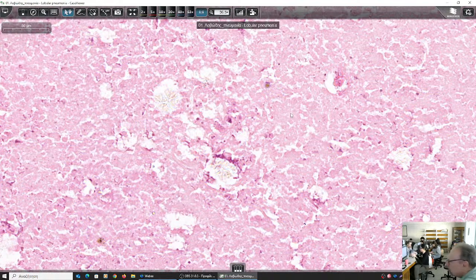We have two stains. One is hematoxylin, the dark one, and the other is eosin, the oxyphilic, the light one, the pink one. Which stains that? Eosin. And what does eosin stain? Eosin stains the cytoplasm, necrosis, and the fibrous tissue, collagen. These are stained by eosin. What can this be? And you see here this dust.